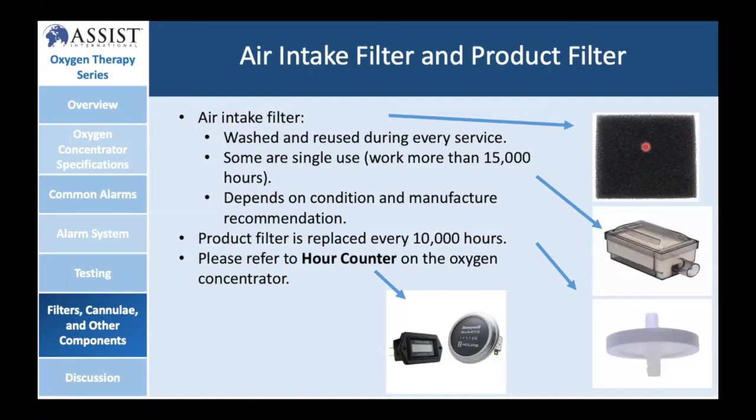Oftentimes, if the unit is overheating, there's blockage. This filter you'll see will be clogged with dirt, with dust. And so it is very important to keep an eye on this almost on a daily basis.